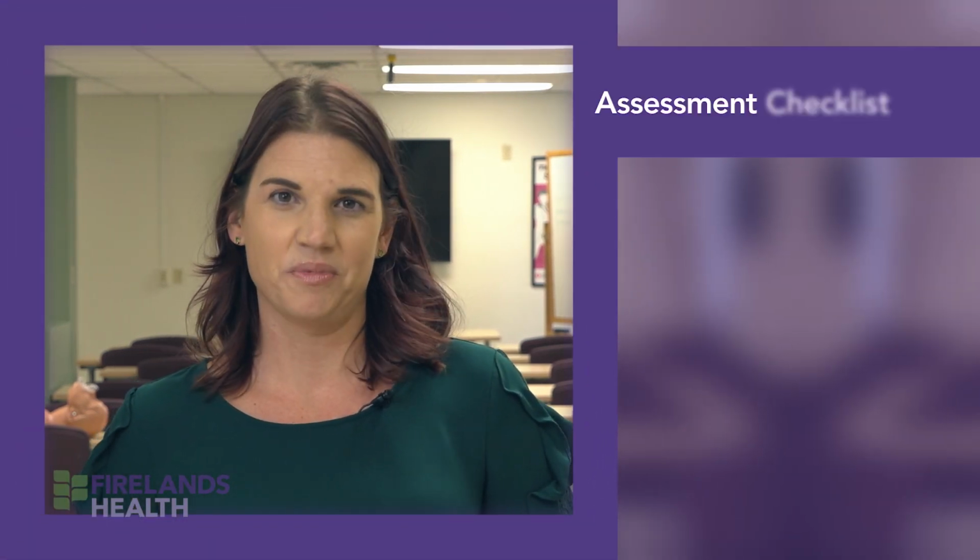AEDs, along with CPR, can help prompt you how to help somebody survive. Today, I'm going to show you how to use an AED. The first step in using an AED is knowing when you actually need to use an AED. So, assessing a person on whether they need help.